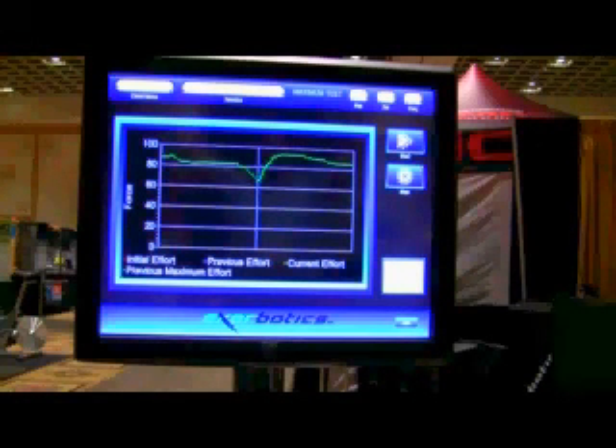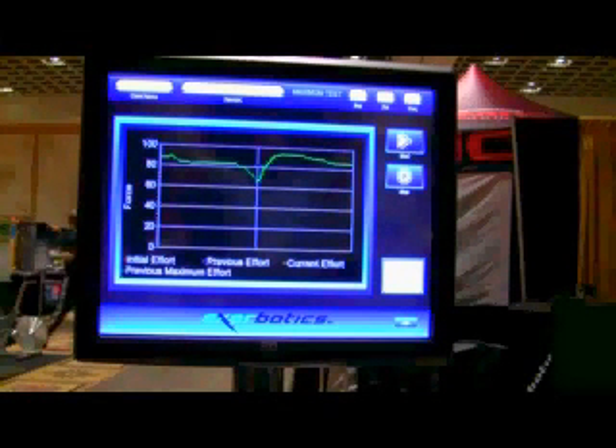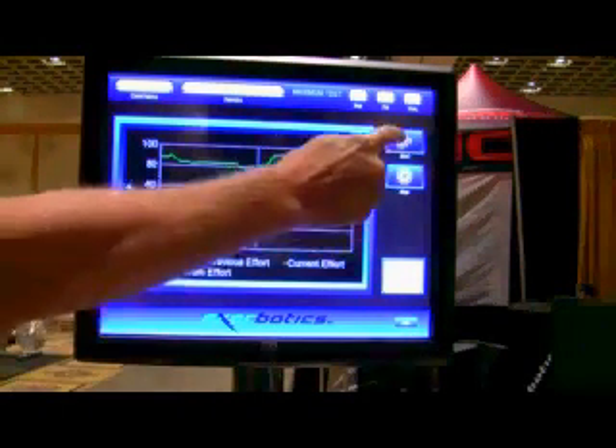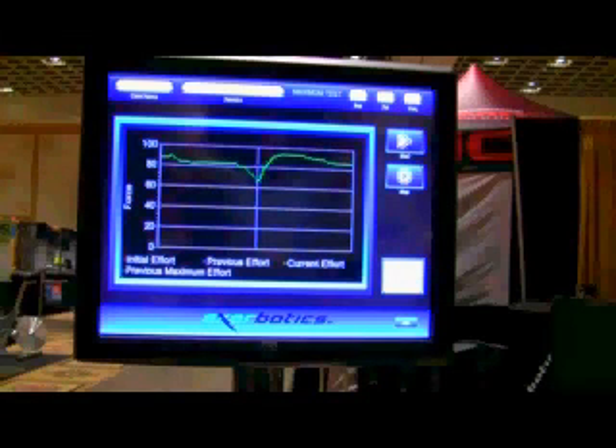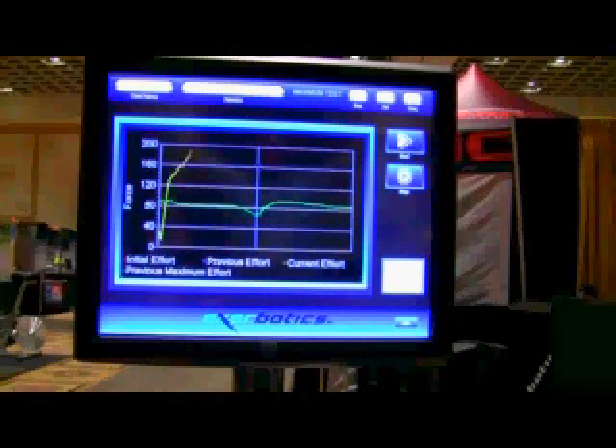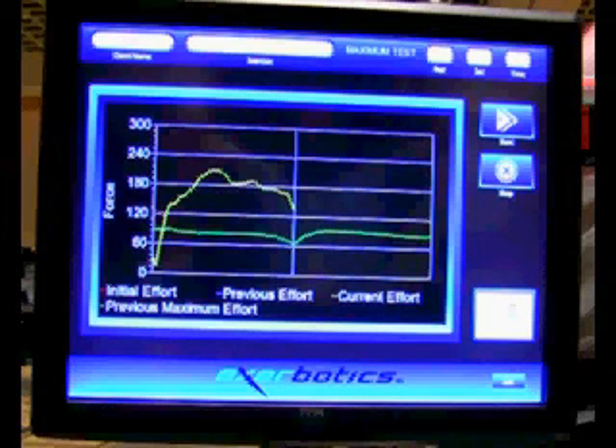This is the heads-up display for the Exerbotics Seated Bench Press, shown just before I perform my first concentric or positive rep. The bar is at my chest and I'm going to be pressing it away as hard as I can. You'll see a yellow line being produced in real time as I'm performing the rep, representing the force output — essentially how hard I'm pressing against the bar. The higher the line, the greater the force output at any given second of the concentric rep. It's not flat, which represents our natural strength curve on the bench press. You're weaker at the beginning when the bar is close to your chest and at the end at full lockout. The middle of the rep is when you're strongest, and Exerbotics is one way to help train that portion of the movement.